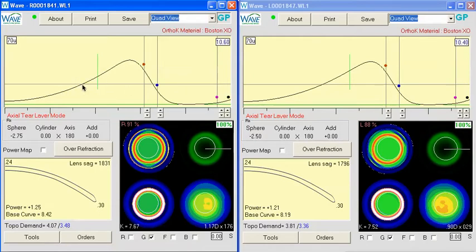I think the key for us is we want to move this point where the tear graph crosses 20 microns. Right now we're at about 3.5 millimeters. We want to move that back as far as possible.